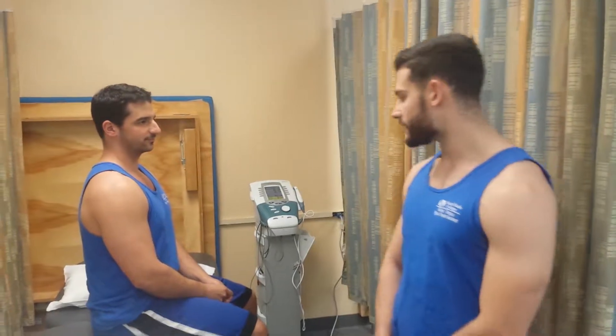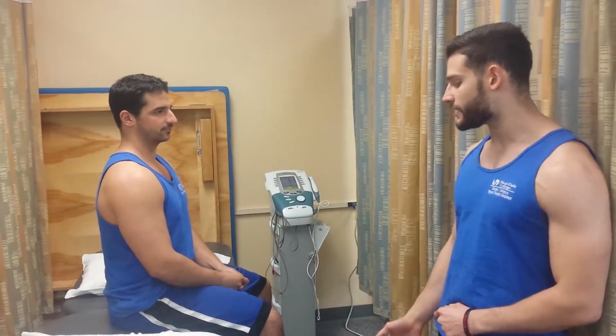Hi, my name is Jose Mesa. I'm a student physical therapist assistant at Miami-Dade and today I'm going to be doing ultrasound on Dan, who has ulcer arthritis in his right knee.